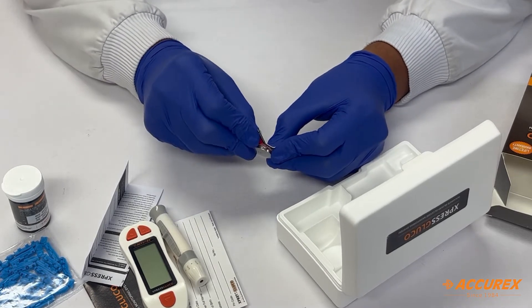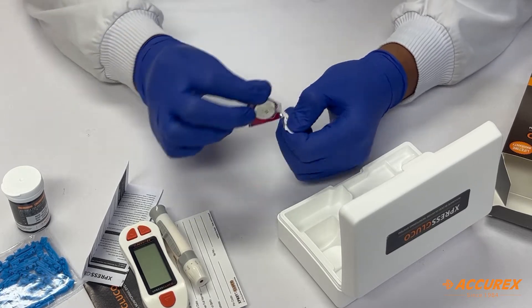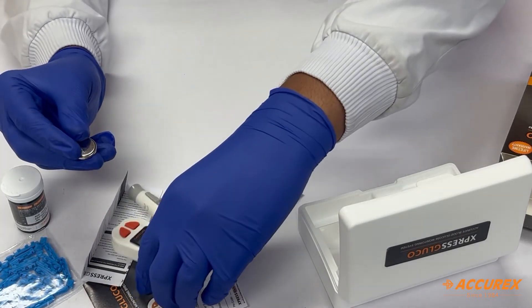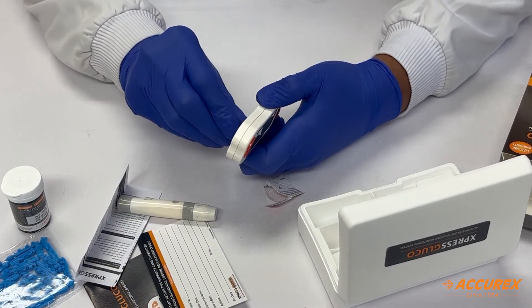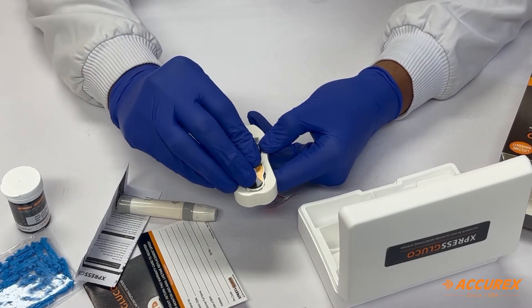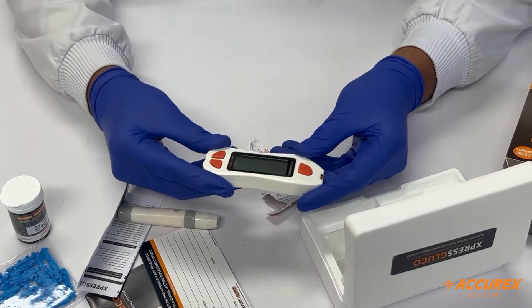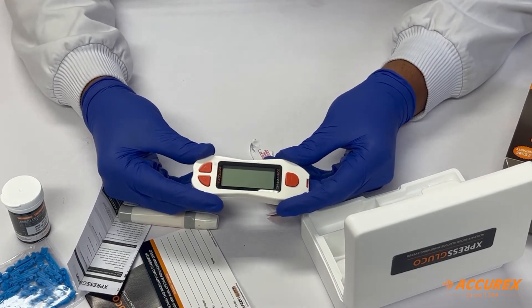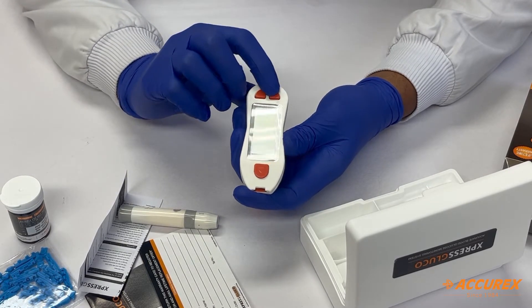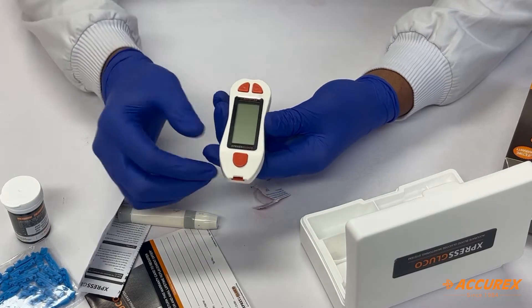Now we will place the battery inside the monitoring system to start the meter. After placing the battery, you can see there are three buttons on the monitoring system. The first button is to see previous readings, the second button is to shut down the meter, and the third button is for strip ejection.